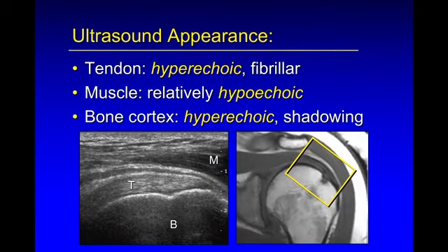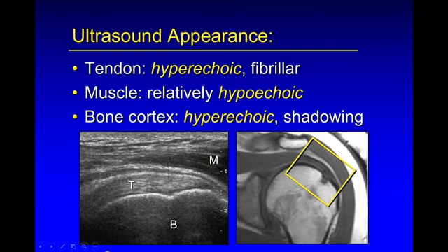So what do normal tissues look like at ultrasound? Tendon has a hyperechoic, or bright, echo texture that appears fibrillar, as shown here. In contrast, muscle is relatively hypoechoic, as shown here in the deltoid, although we see intervening echogenic fibroadipose layers. The bone cortex is hyperechoic with shadowing, as shown here. Note the MR correlation showing the field of interest that we'll be seeing with ultrasound on this example.